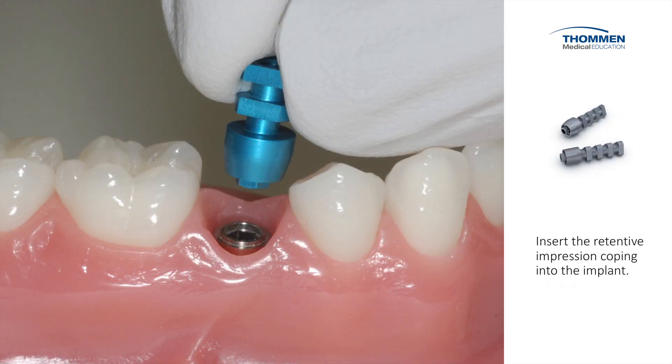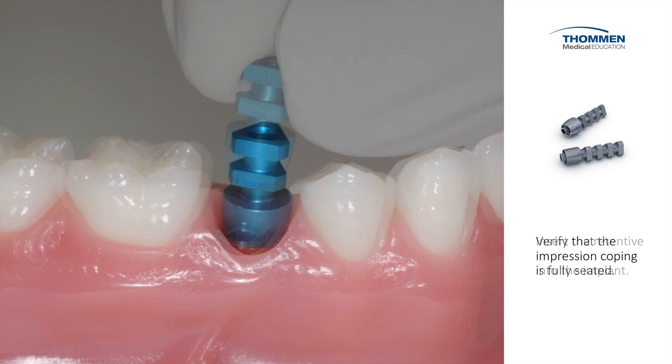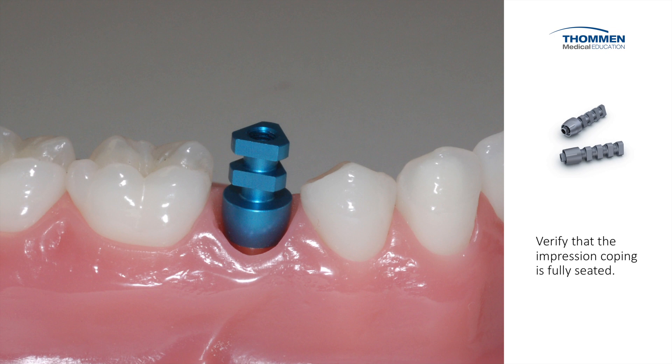We insert the Retentive Impression Coping into the implant. We verify that the impression coping is fully seated, that there is no debris, and that no tissue is trapped underneath the impression coping.